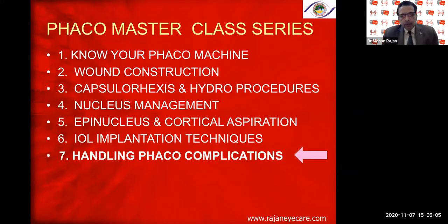And this week we are going to cover, and this is going to be the last of this series, handling the phaco complications. And handling the phaco complications is very necessary. If you handle the complications and give optimum results to the patient, that is exactly the difference between an ordinary and an extraordinary surgeon.